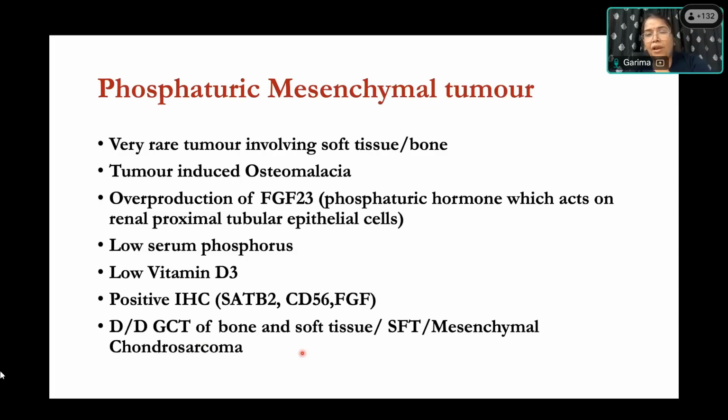I hope you all have understood the morphology of this case because it is a very rare case. Maybe I've seen only 1 or 2 cases in my lifetime. When we first got this case, we thought that the technician had not cut it properly. Then we inquired about the history and found that the phosphorus levels were low.